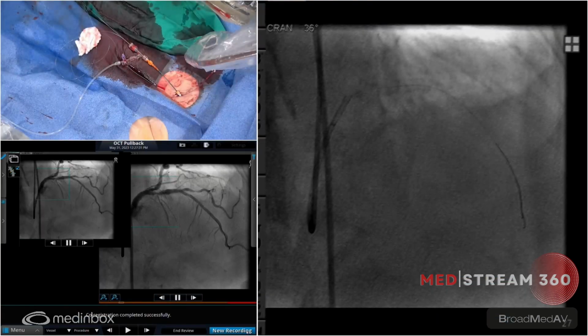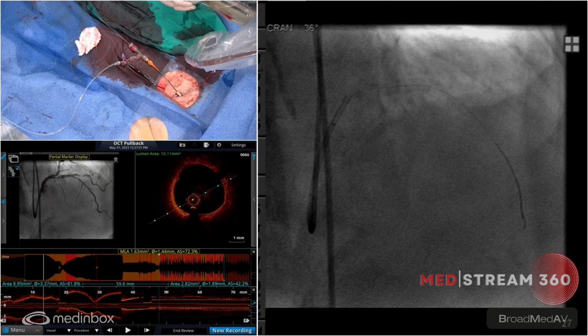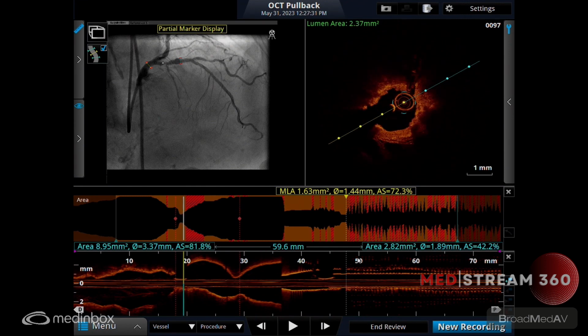I think that's a good one. Looks good, yeah. All right, so we can start off here quite distally. You can see the calcium already extending, deep calcium there, distal to the vessel of interest. Here's the area that we're coming to where we ablated. Ooh, let's look at the nodule right from above. Deep penetrating nodule all the way. You can't see anything past that.